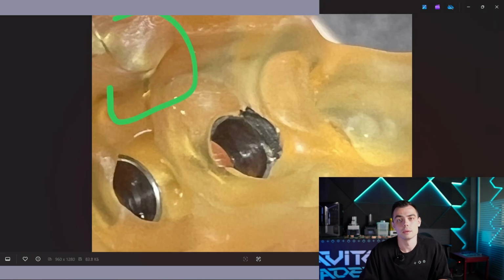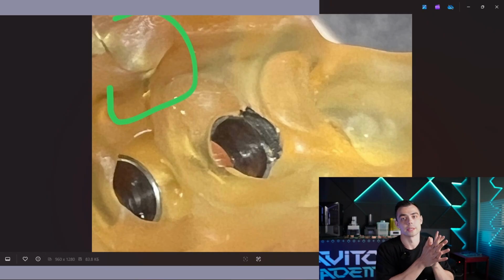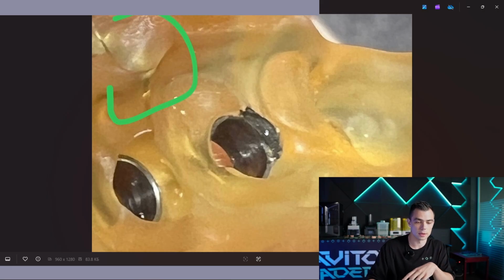So why is this double check needed? It's just because sleeve manufacturers sometimes change the outer diameter and the internal diameter of the sleeve. The example of a changed internal diameter was in the previous photo and in this photo as well, and you see that the drill made metal layers from the sleeve during the surgery.